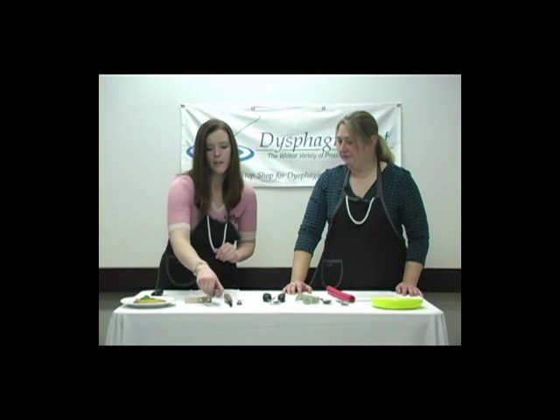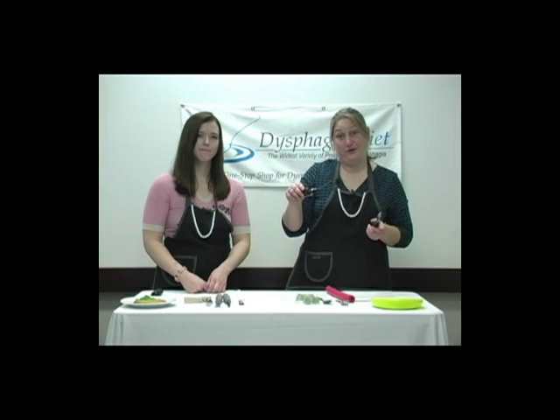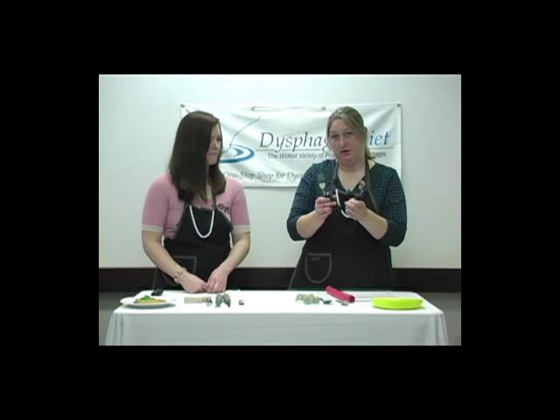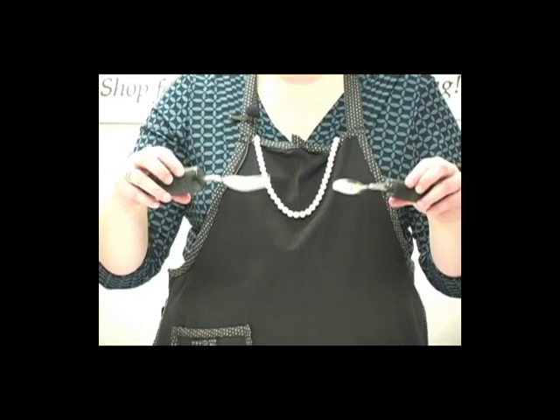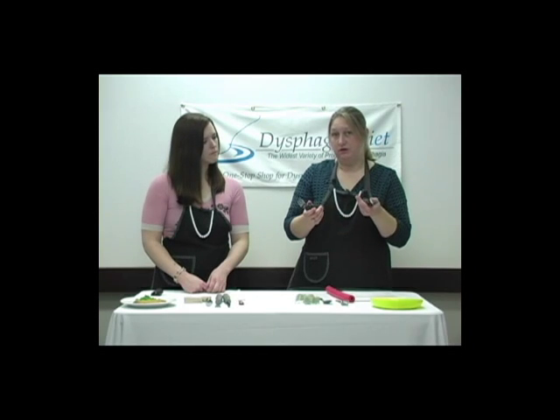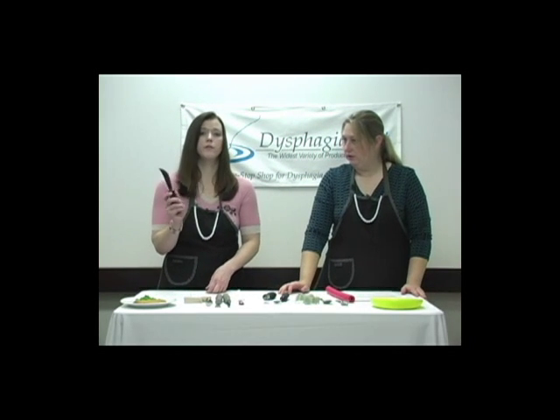You can also get utensils that are weighted. The extra weight can help a shaky hand improve control and stability. Some utensils are good for right-handed use or left-handed use. These particular utensils are bendable, so you can bend them in the angle which you need. These utensils are used for someone that has a limited range of motion, and this is also called contracture, where your muscles tighten.